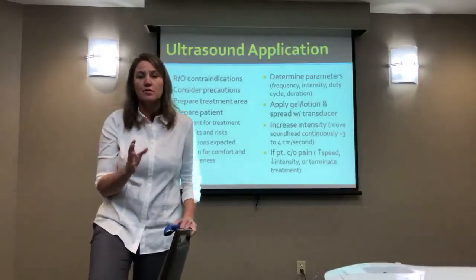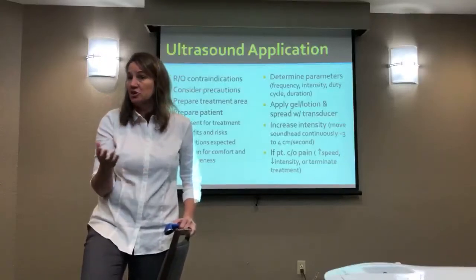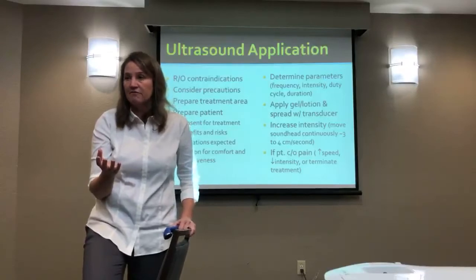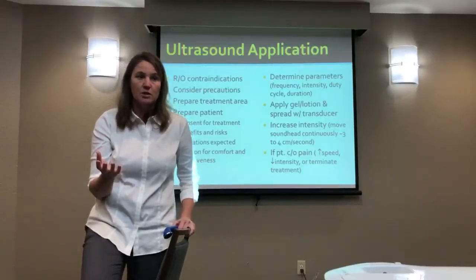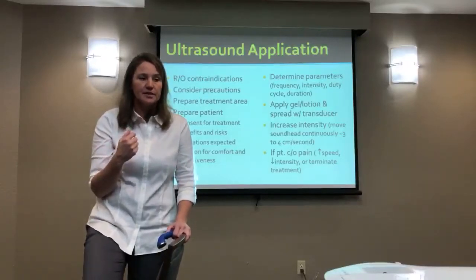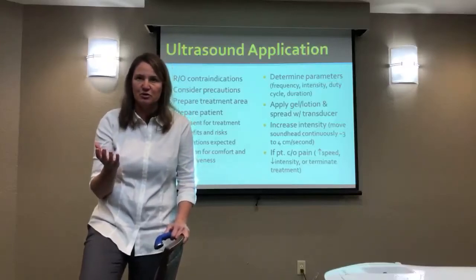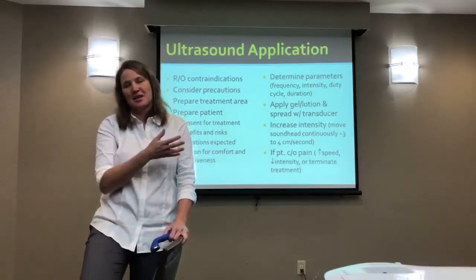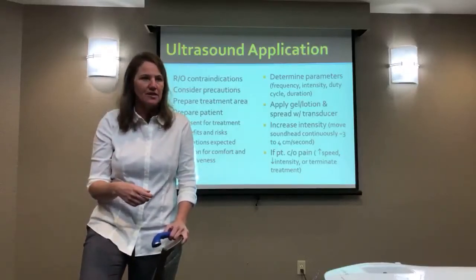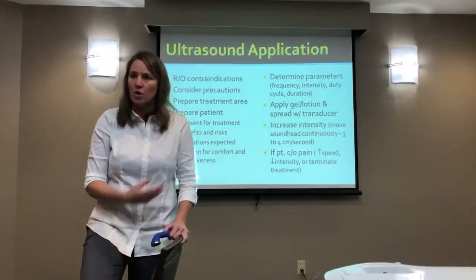So you really want to communicate with your patients why you're doing something, what they should feel, what they shouldn't feel, because you could also have that patient who could be experiencing discomfort and they don't tell you until it becomes literally unbearable. I've been guilty of that when I was getting a massage one time, just thinking that doesn't really feel good, but you don't want to say anything because it's a nice person. But I don't want that. I don't want to be doing something with a patient that they're withholding information about discomfort. That's not okay. I want to know.